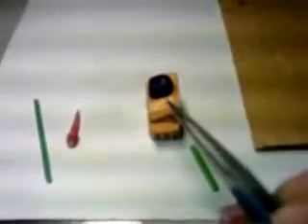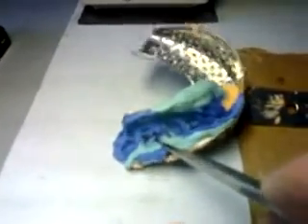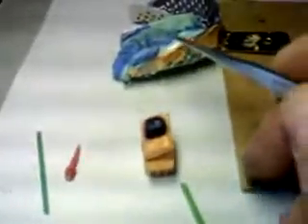At this point, we would say that only one material has been involved in this working process compared to the post core done on the model, because once it's done on the model, we do have more than one material. We have to keep in mind that the first material we had to deal with was the impression material, which has a margin of error when it sets up. Then we had to deal with the die material, the gypsum, which has another contraction and expansion, so it might give a margin of error. And at last, the wax. So we deal with 1, 2, 3 materials before having our core. Now what that means is that if we have a margin of error of 1 plus 1 plus 1, we'll have a margin of error of 3.